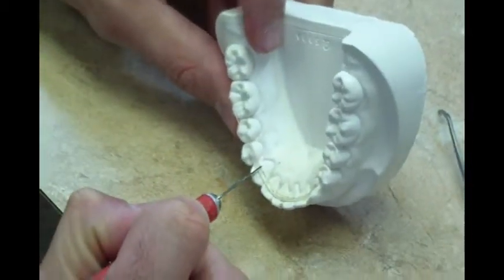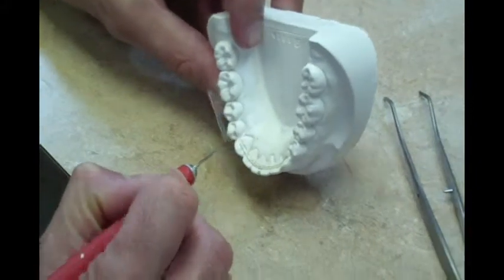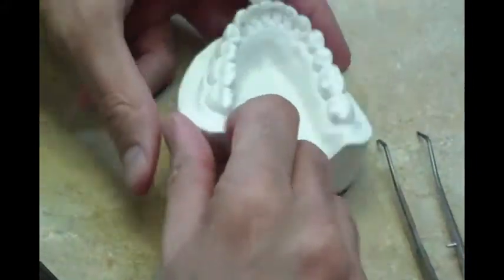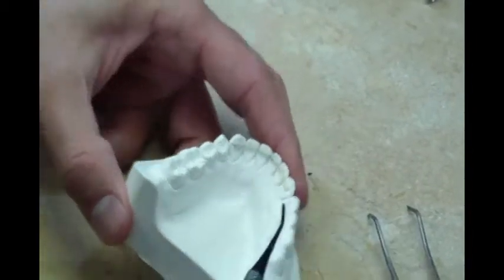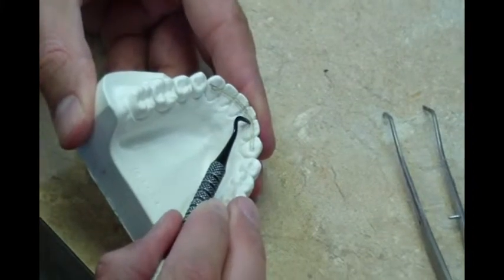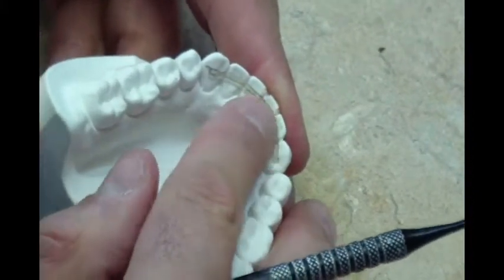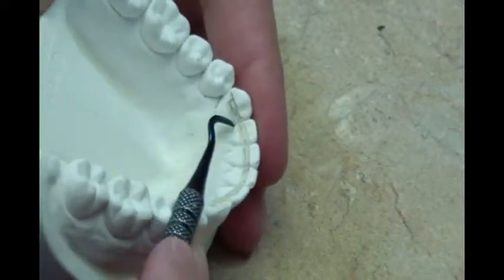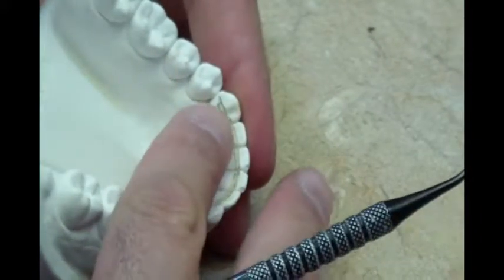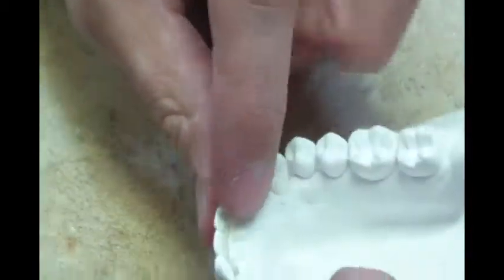Trim off any excess length of wax, stopping just short of the distal contact point. Using a hand instrument and your finger, ensure that the wax strip is properly positioned. Then carefully apply firm pressure with your finger to ensure the wax is completely adapted to the tooth surfaces.